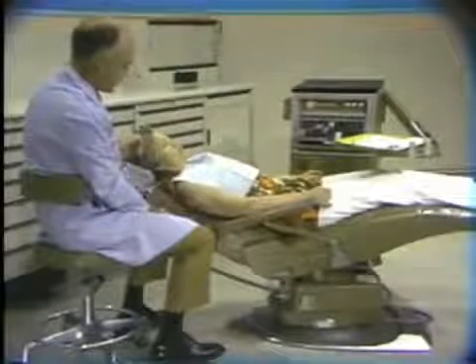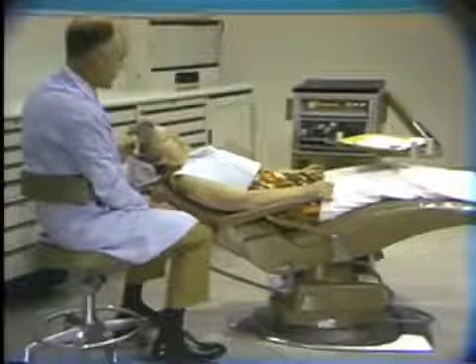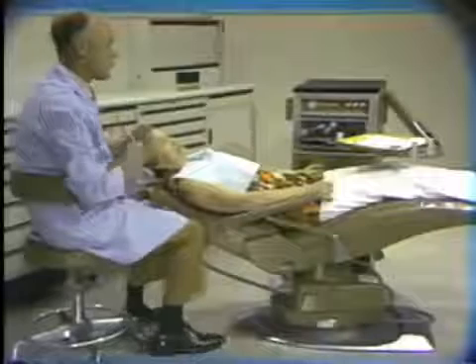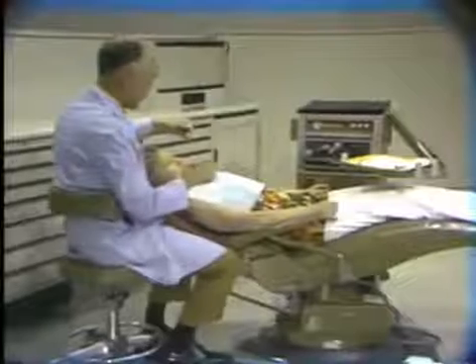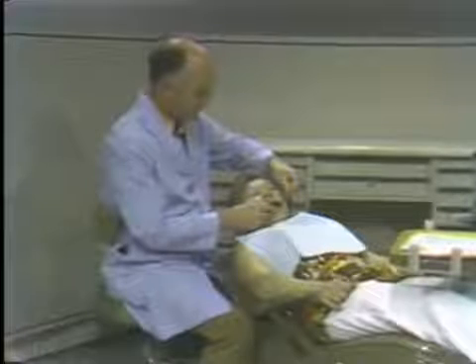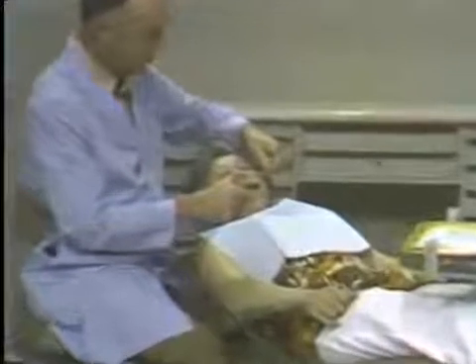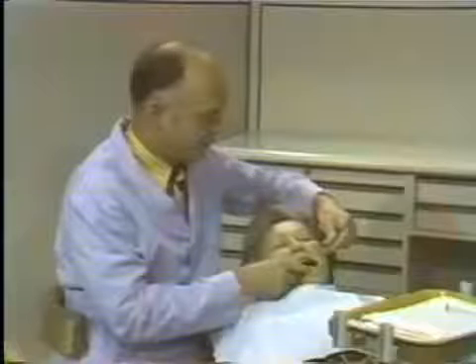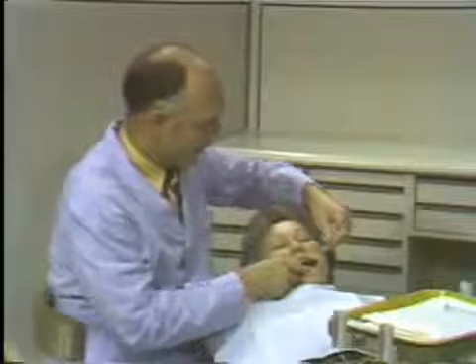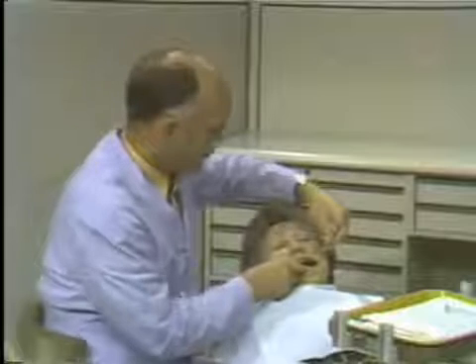The chair should be raised slightly so that the operator can assume his position at about the 11 o'clock position behind the patient. The knees will have to be separated in order to get them behind the back of the chair. Visibility should be excellent onto the lower left quadrant. This is what you should see into the lower left quadrant. As you move further back to the posterior, it will be necessary for the operator to move his operating stool further around to about the 9 o'clock position.